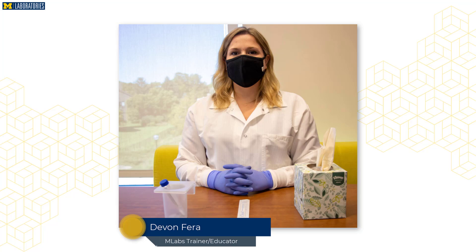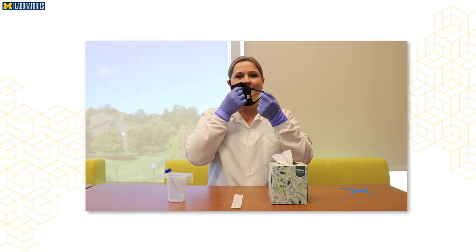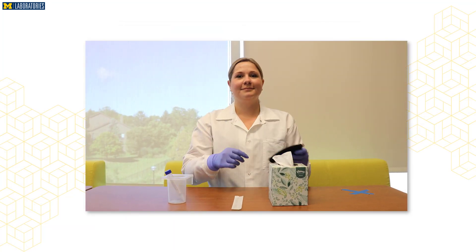This video will demonstrate how to perform the mid-turbinate self-collection using a flocked swab. The collection procedure takes roughly 30 seconds and is slightly uncomfortable. You will place a sterile swab into both of your nostrils and rotate several times to collect cells and mucus. You will place the collection swab into a vial labeled with your information, sealed, and referred to the Michigan Medicine Clinical Pathology Laboratory for testing.